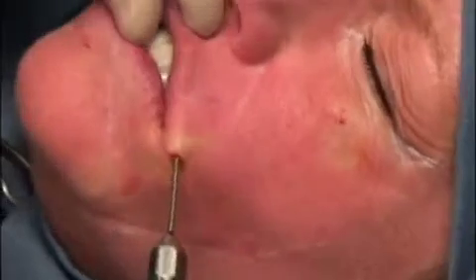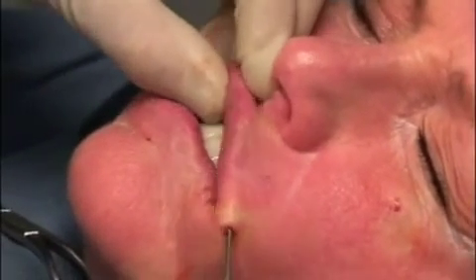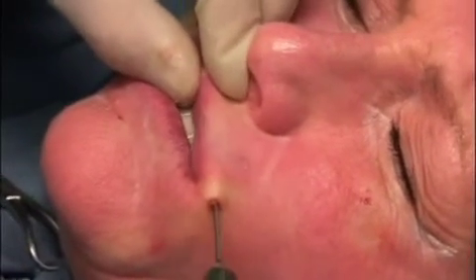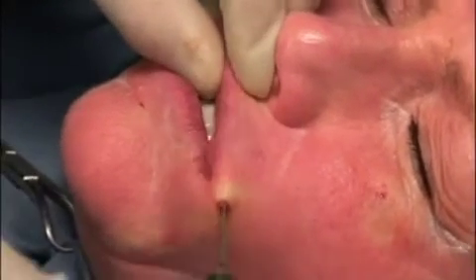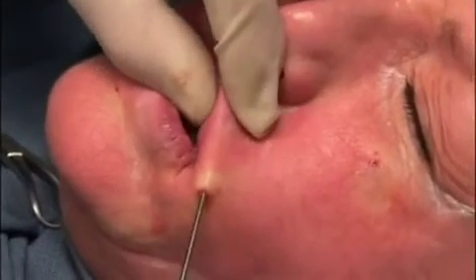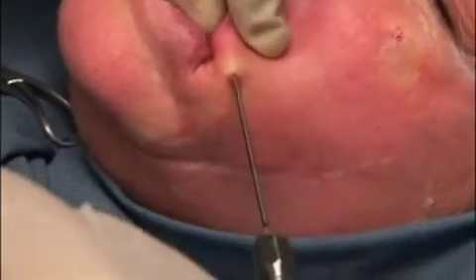The lips are the only area of the face when I perform fat grafting that I actually inject lidocaine into the area to be grafted. The reason I inject local anesthesia into the lips is that the lips have a vast blood supply which can cause bruising and bleeding during the procedure. I put the smallest quantity of lidocaine possible to produce anesthesia in the lips.